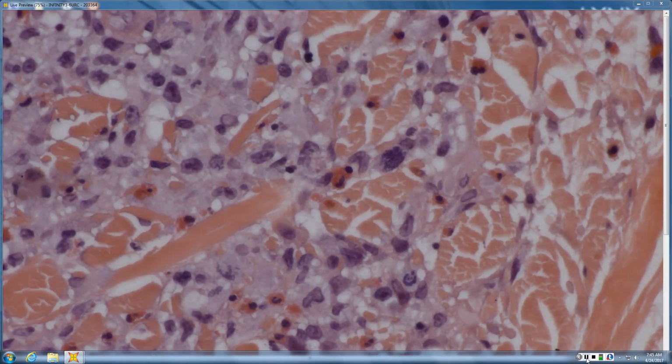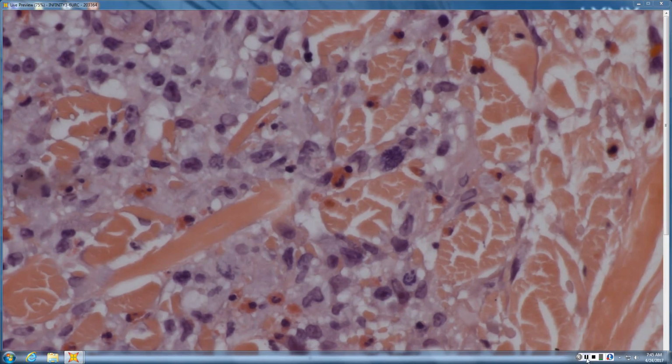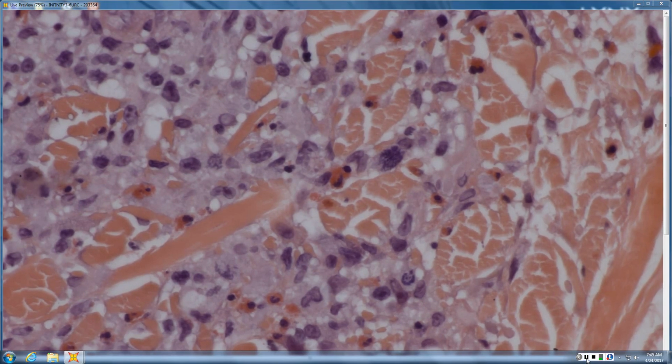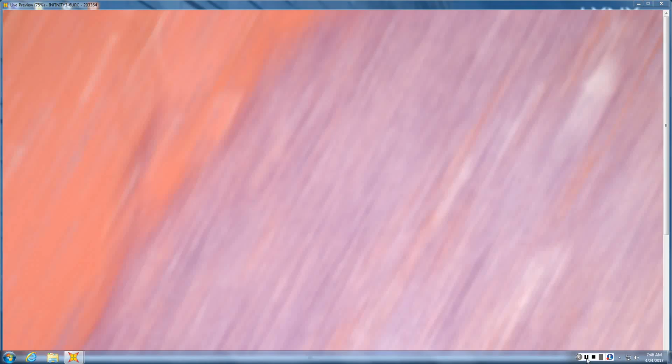The other thing that could have EOs and atypical CD30 positive cells is a bug bite, right? In a bug bite, your CD30 cells are going to be scattered, and LYPs are going to be sheets and clusters. So lymphoma or lymphomatoid papulosis, you have sheets and clusters of CD30 cells. In a bug bite, each CD30 cell sits by itself. Never in clusters, never in sheets. So that's kind of your differential for that. And this one is a little folliculotropic.